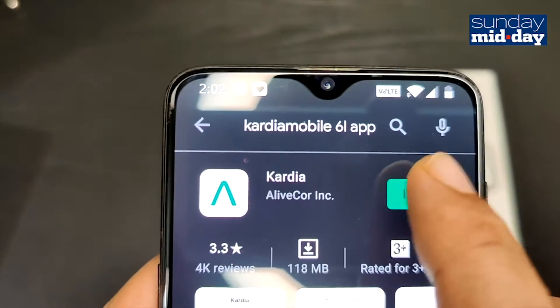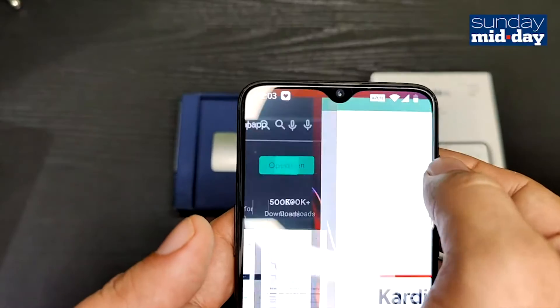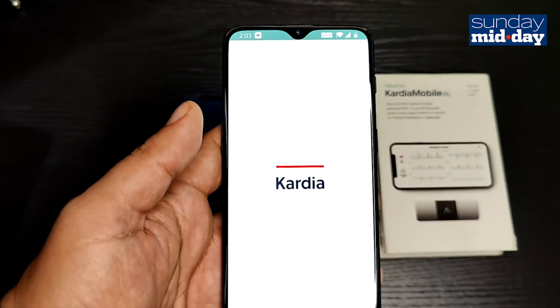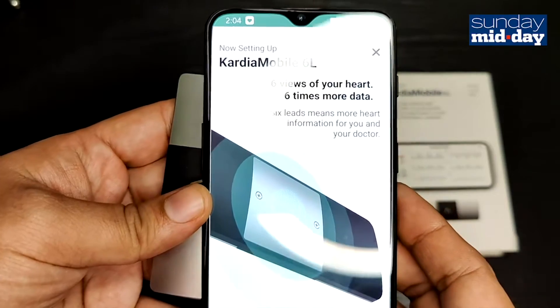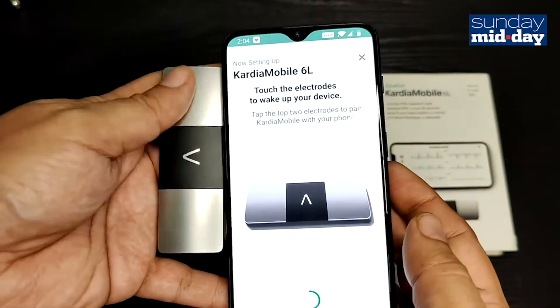You start by installing the application on your phone. Once you have installed the application, you have to pair the device with your phone by touching it to the phone. It's one of the simplest pairings I've experienced.